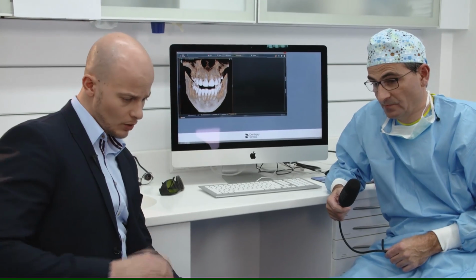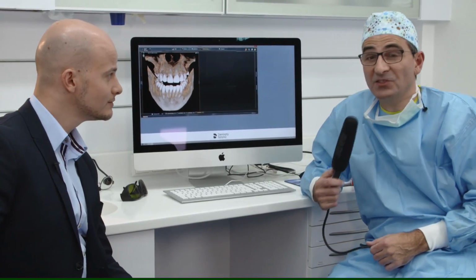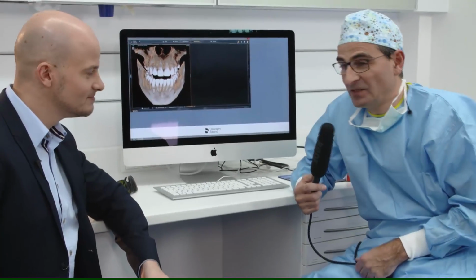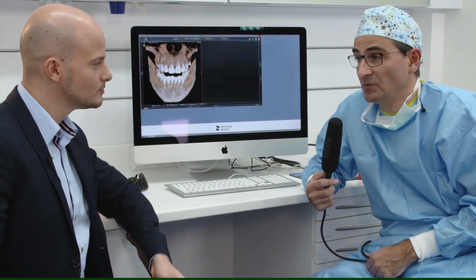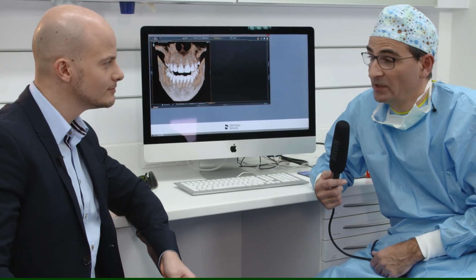What was the biggest challenge during this surgery? The biggest challenge is to do it live. You always get a little bit nervous when you do it live, because you think someone is watching your fingers. But as we are working on it, it's still the same as always, so it was not such a big challenge. Only to know what bone we will find, and that's the point in this case.